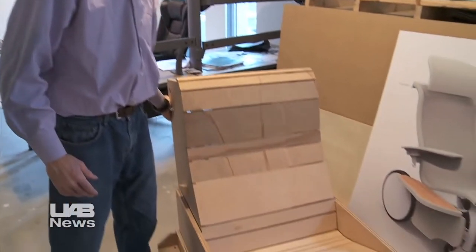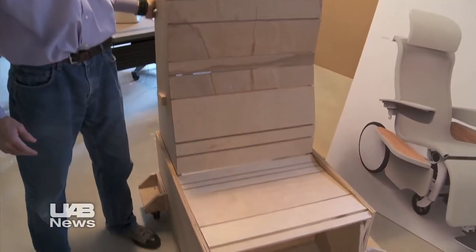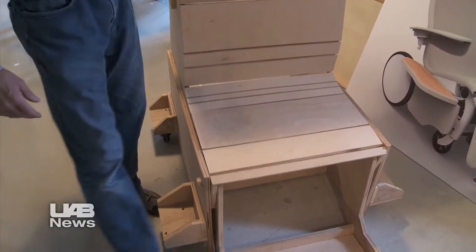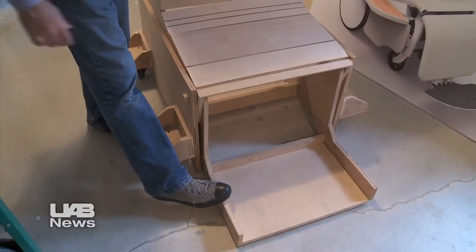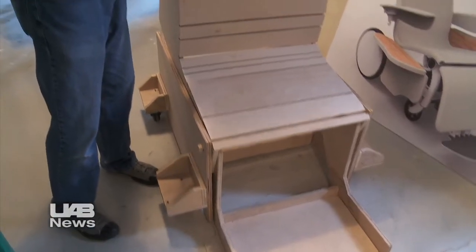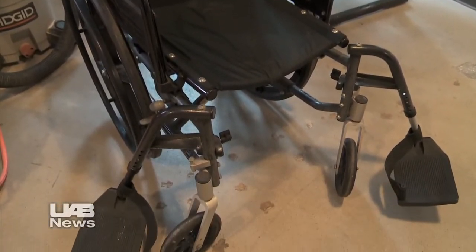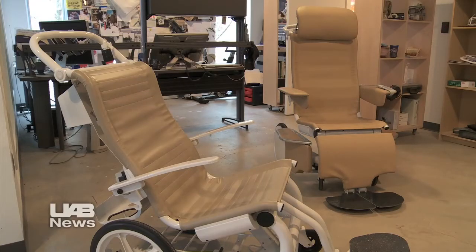What if you had an axis on the chair, so that it could pivot and move forward like this, and the footrest could actually come down flush to the ground? That's the prototype of a new kind of hospital chair, aimed at replacing the old-fashioned wheelchair. It's called a Movi. Lloyd Cooper is the designer.